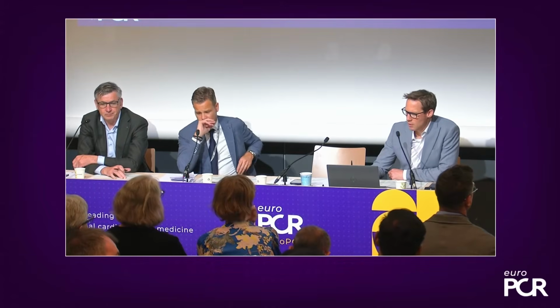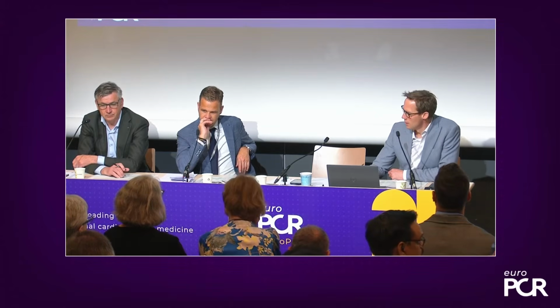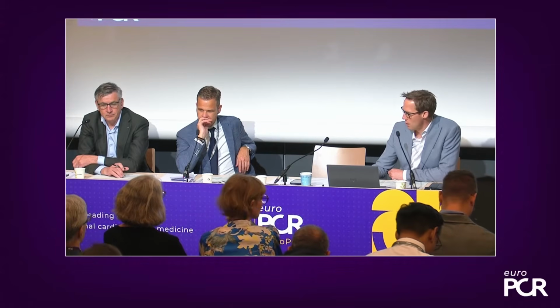Lars, can I ask you a question about the protocol? Because when we ask for a CT of the LAA, we get a CT coronary angio or we get a CT TAVI. Is there anything else that we need to be asking our radiologists or our radiographers to do with the scan protocol, specifically to rule out thrombus?